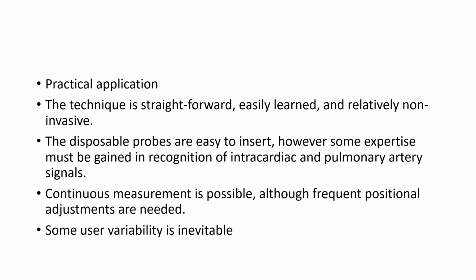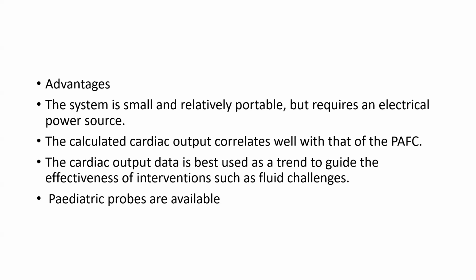Continuous measurement is possible, although frequent positional adjustments are needed. Some user variability is inevitable. Advantage: the system is small and relatively portable, but requires an electrical power source. The calculated cardiac output correlates well with that of the pulmonary artery catheter.